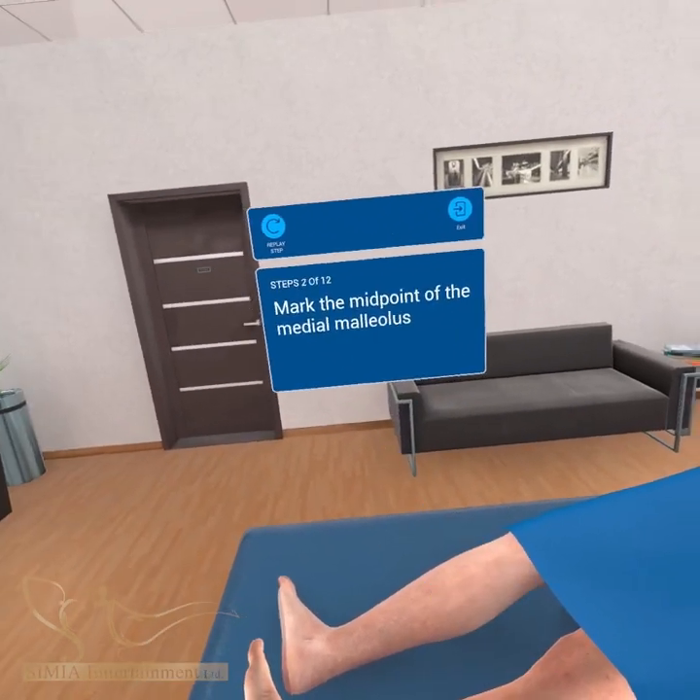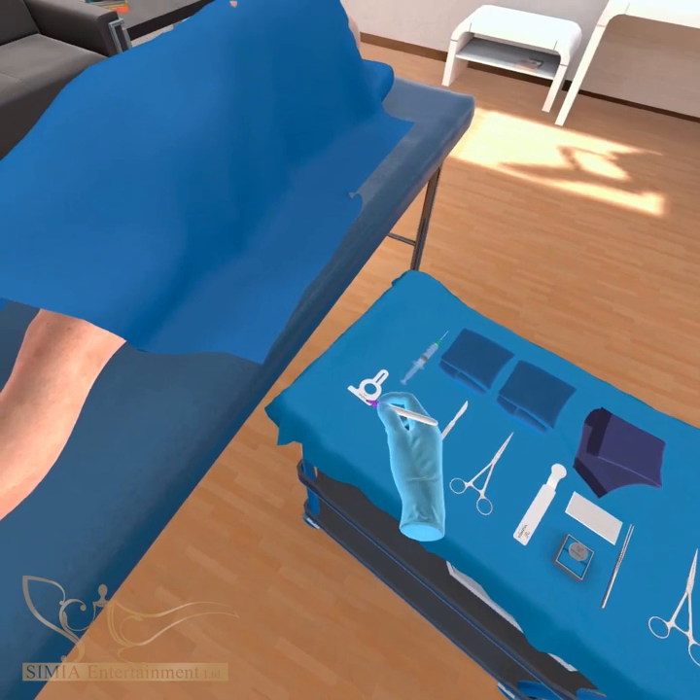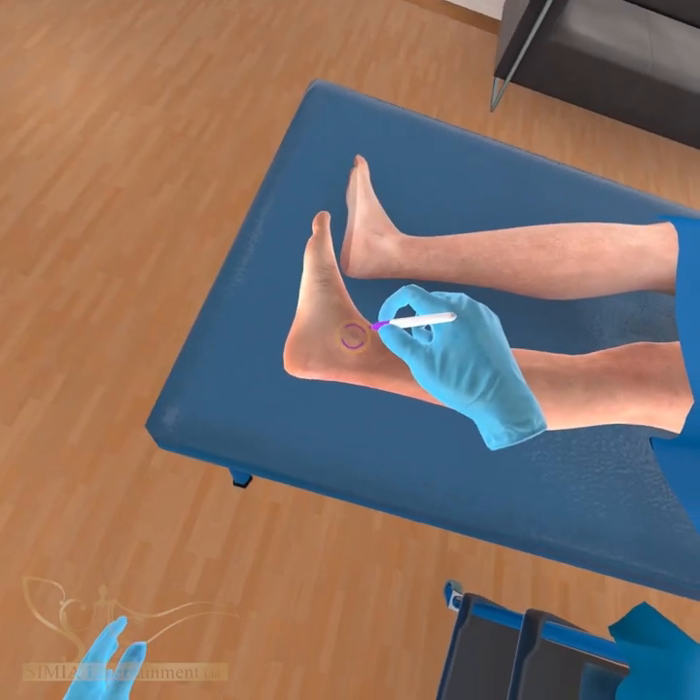Next, mark the midpoint of the medial malleolus using the custom two-sided template tool.